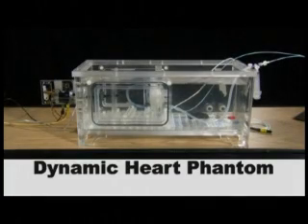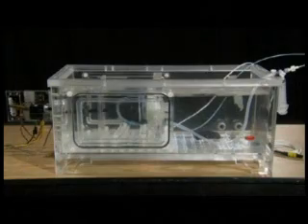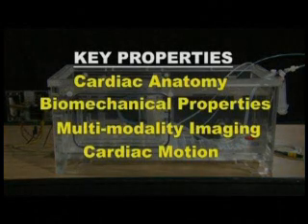In this video segment, you'll see a novel multimodality phantom that we've developed for our experiments focused on the imaging of cardiac structure and function. You'll see an overview of its key properties and a range of different applications in which it's being used for research activities at the lab.